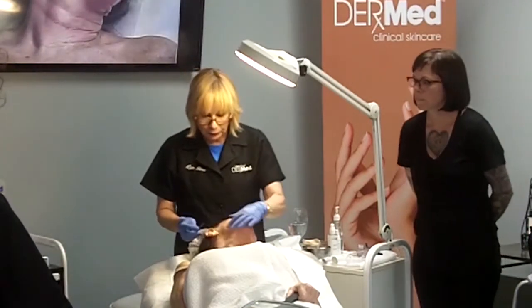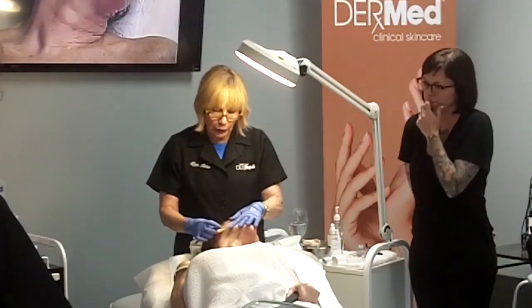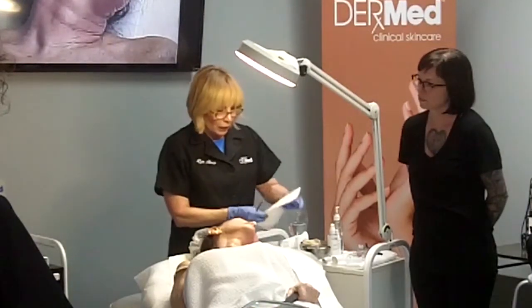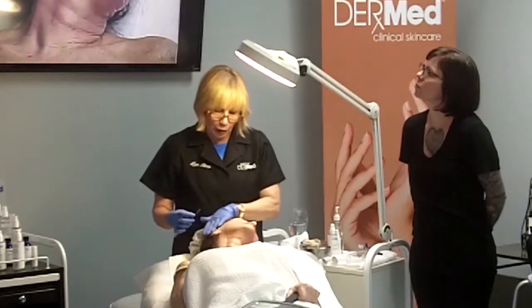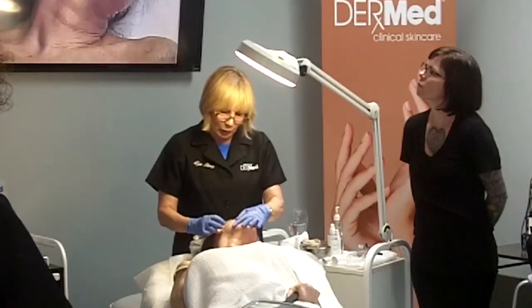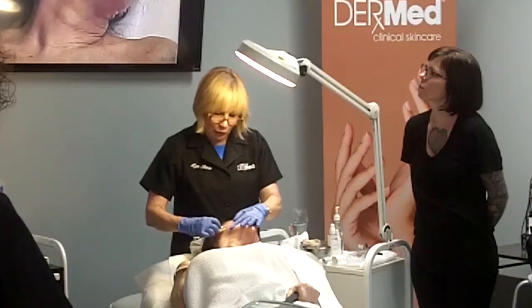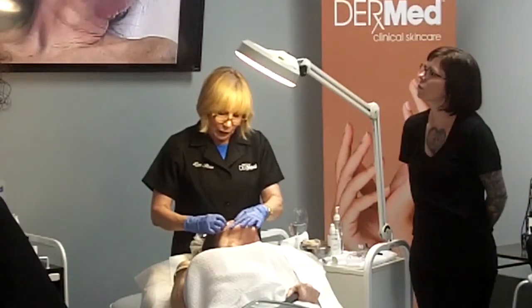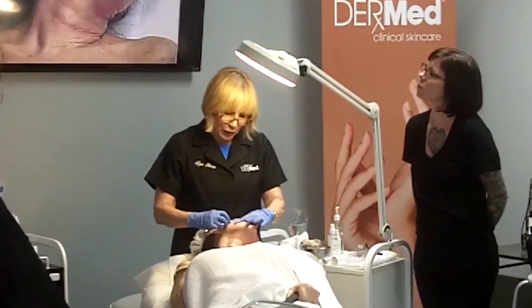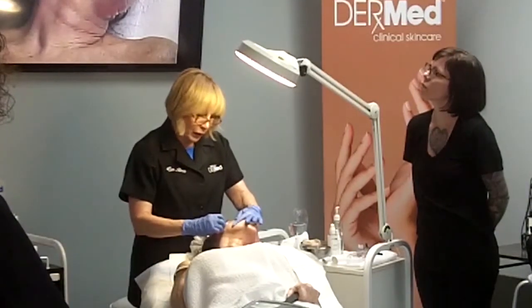You can just do this side. Pull the skin a little bit taut. I don't need it tight as a drum, just a little bit of a tight surface. I need a tissue there so I can build up any debris I pull off. Now, I don't do the dermaplaning before needling, because if I did, the needling would be ten times more sensational on the skin. The needling makes little pinpricks and loosens the corneocytes, so I actually get a deeper peel with the dermaplaning blade when I do the needling first.